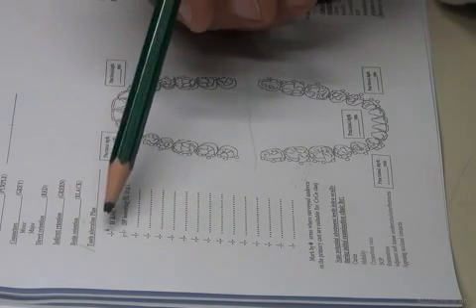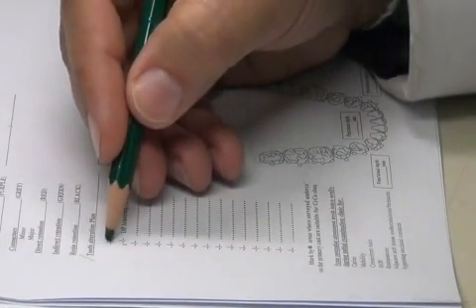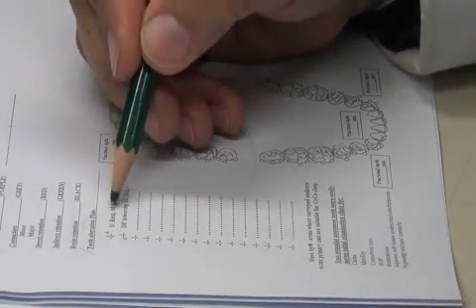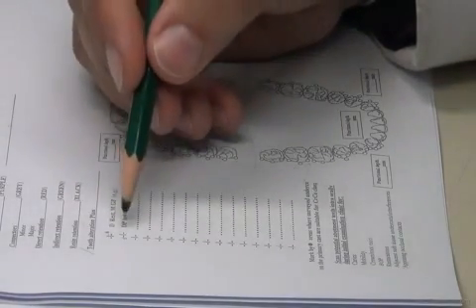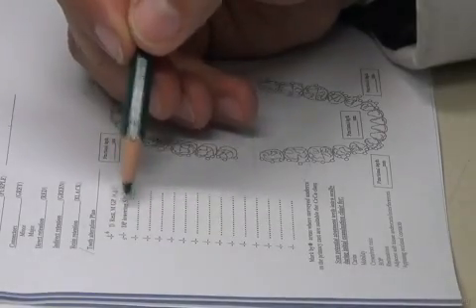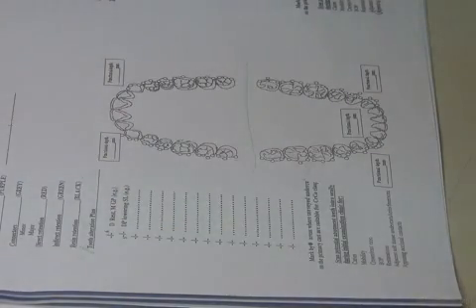For example, this is a case, distal rest, upper 6, upper right 6. Of course, this is designed in a way to have a cross. This is the cross in the middle, okay? So upper 6, we have a distal rest, and we have to prepare for a mesial guide plane. Some teeth you need distal lowering of, for example, distopalatally, you need to lower the survey line, for example, okay? So these are types of preparation and how you write them.